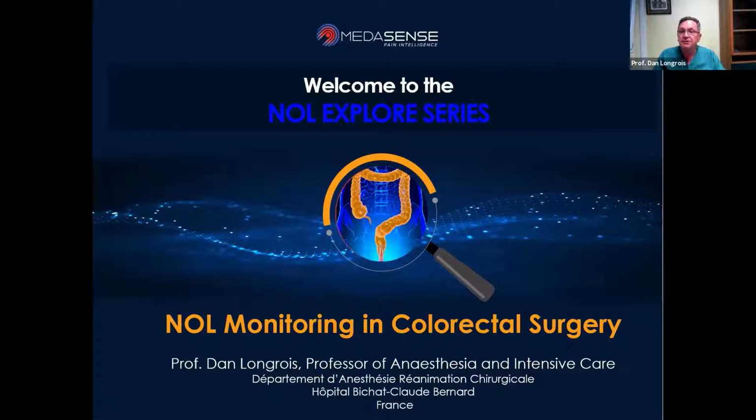So the first is avoidance of intra-anesthetic arterial hypotension. The second is as low as possible post-op pain intensity and duration. The third is fast bowel function recovery. The fourth is decreased post-op pulmonary complications. And the fifth is shortened post-operative length of stay. So you see, it's a mix of clinically patient-oriented and institution-oriented goals, and you have to define the 2 most important for you. So take a few moments to vote. And if I can have the second poll.